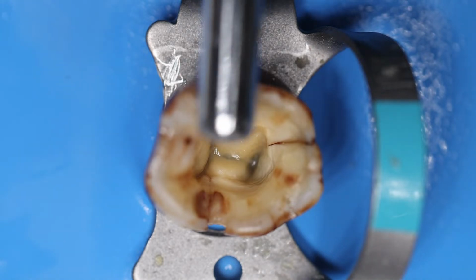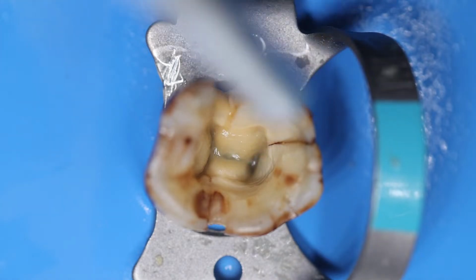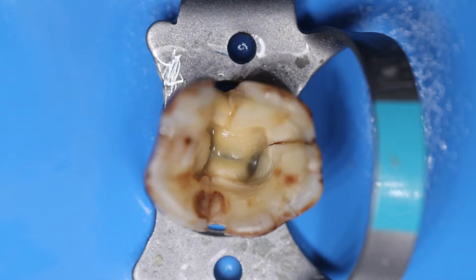Always use a 3-way syringe in a horizontal direction, away from the direct vertical approach. Okay, just like this, and you are in the canal orifices. Right, now you can begin with other things also. For example, you can use the GG drills in some of the cases.